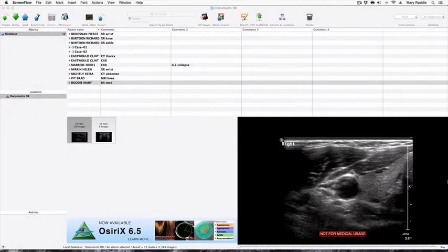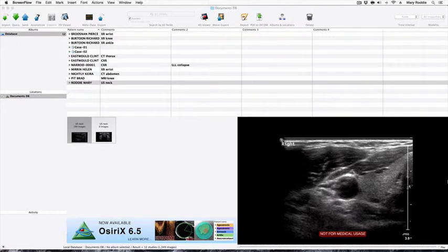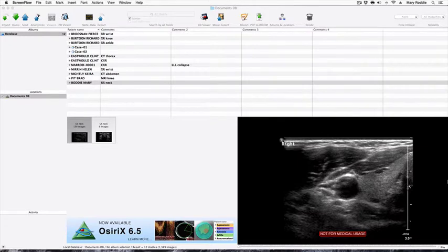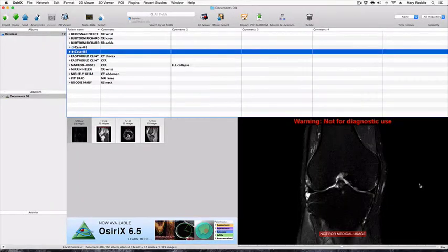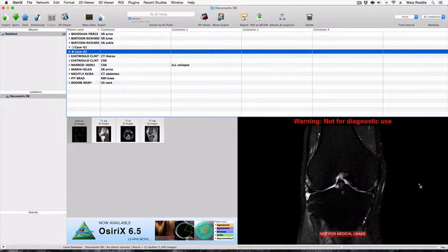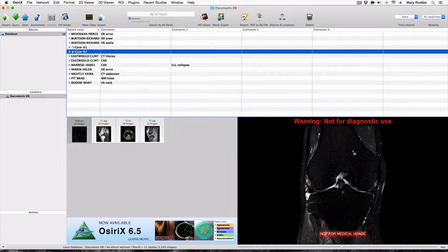This technique can also be used for nuclear medicine studies or other images where there is patient sensitive information on the edge of the image that you wish to exclude. This technique can also be applied to get rid of the warning not for diagnostic use logo that has been burned onto the images of the MRI knee, which we imported previously from JPEGs.